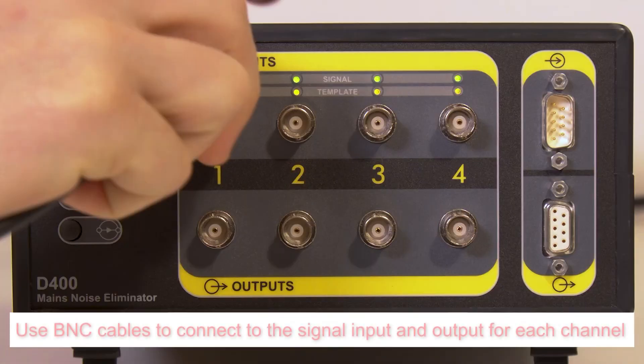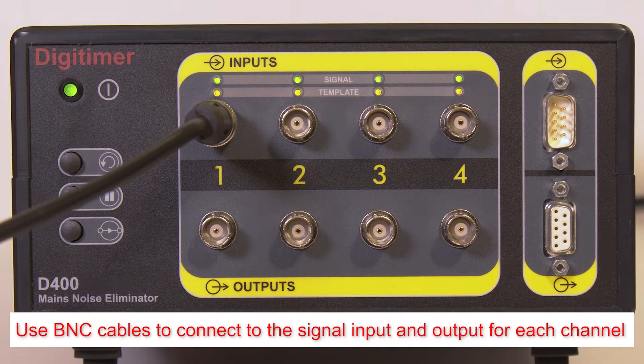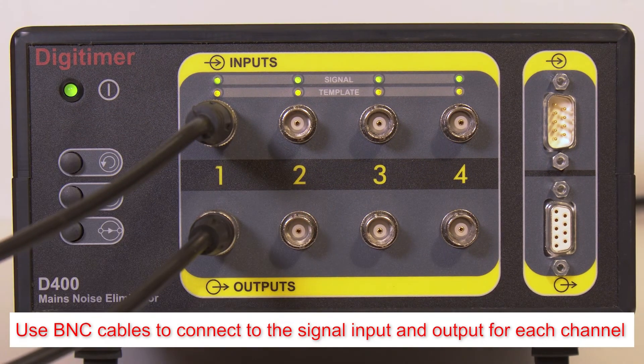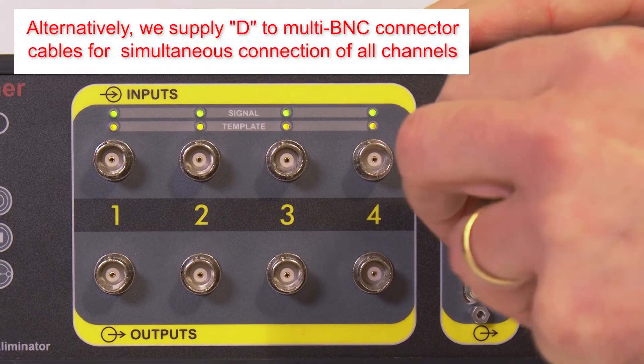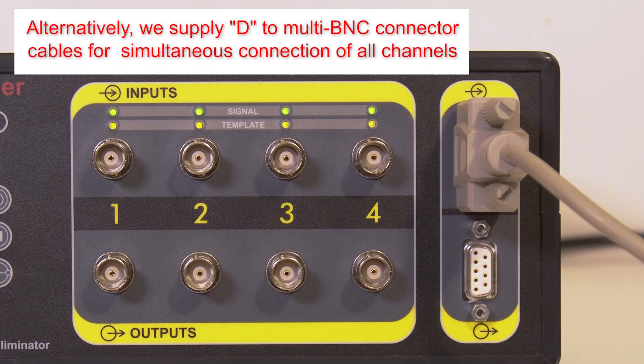Amplified signals may be fed into the D400 via BNC cables connected to the upper row of sockets. The lower row provides the signal outputs and these should be connected to the data acquisition system using additional BNC cables. Alternatively, the D400 also features a pair of D-connectors on the front panel which serve as multi-way input and output ports.